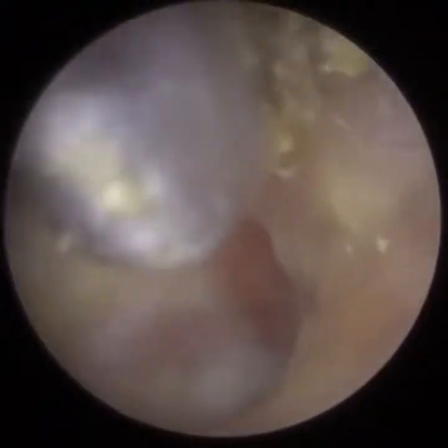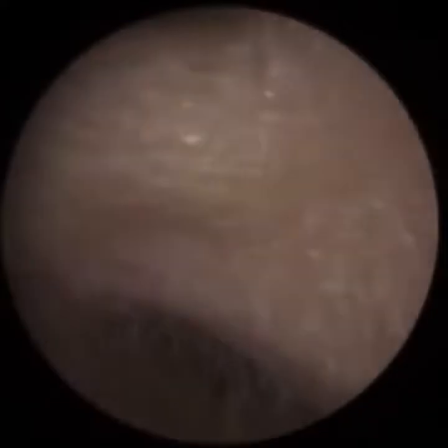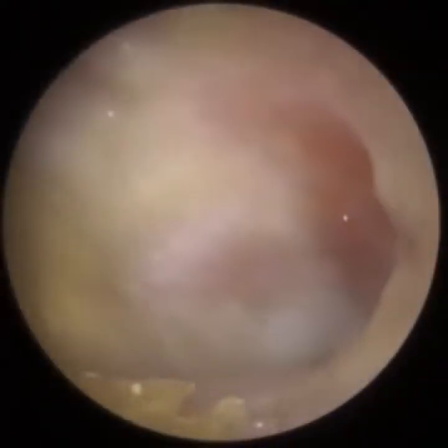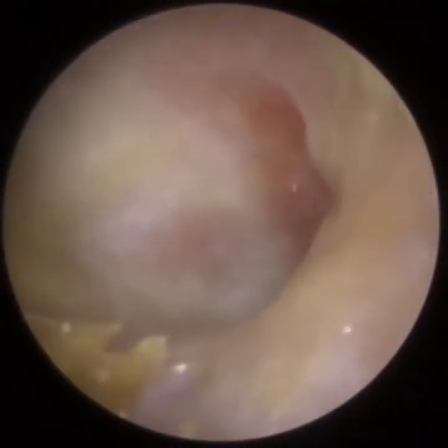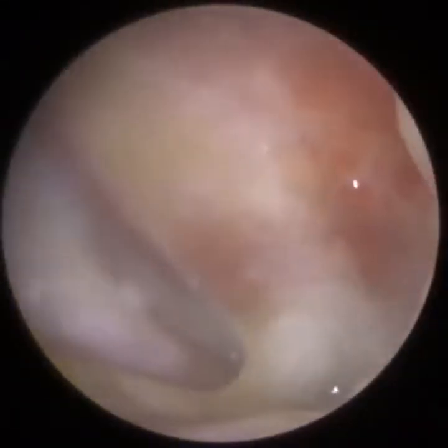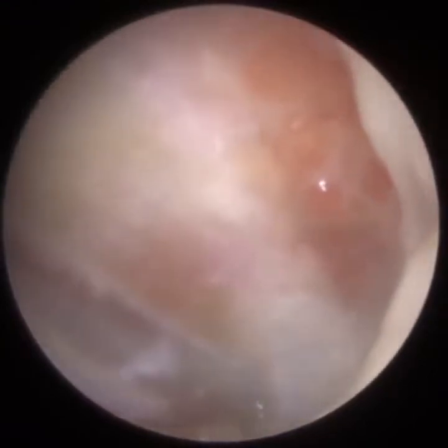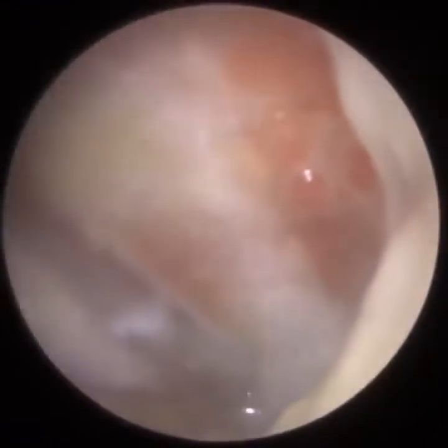I think they left it a bit longer than usual on this occasion, and I did actually get some water in the ear. Now, water is really bad for the ear, guys, not only for this particular patient because of their chronic history of ear infections, but for everyone, really. I always compare water in the ear to kryptonite to Superman. It's the arch enemy. So really, really avoid water being in the ear.